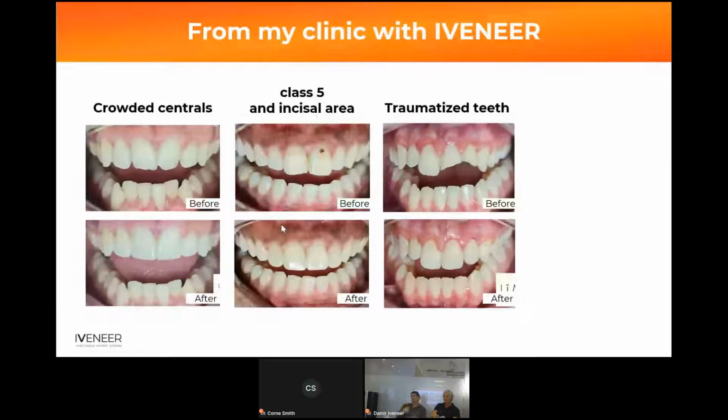So in this case, you have to do a very thin palatal shell, and on top of the very thin palatal shell, of course, you have to do a beveling, a correct beveling, and I can teach you how to do it, and a very thin dentin opaque shade, which will cover half of the beveling, and then put the matrix and inject the rest of the final layer.